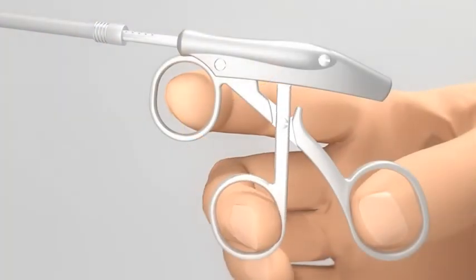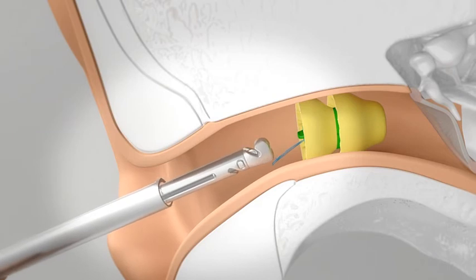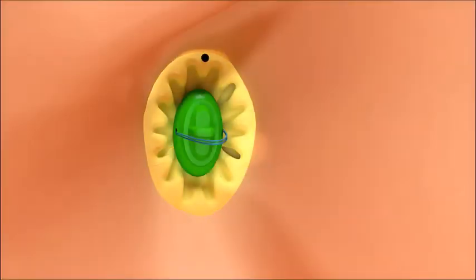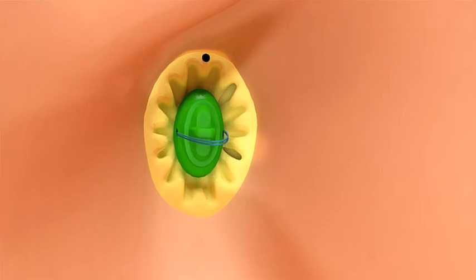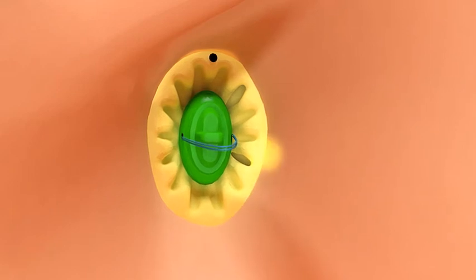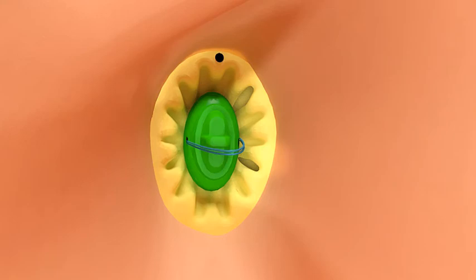Release the sizer by pulling back the moving tension ring completely. Remove the insertion tool. Once inserted, check the fit of the small sizer. If all sides of the seal are touching the ear canal wall without any gaps or folds in the seal, and if the insertion was smooth and comfortable, the patient wears a small device.